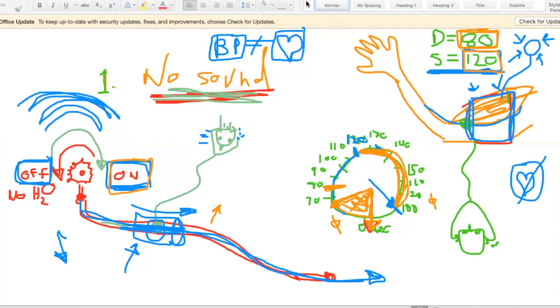But between these sections, between 80 and 120, I've got a unique situation going on. Now, if the cuff is pumped to 180 millimeters of mercury, slowly you take the rubber ball, and right next to it there's a little dial that you can loosen to let the air out of the cuff. You pump the cuff all the way up, you crimp the artery, you're not going to feel or hear anything, and you loosen this little dial.